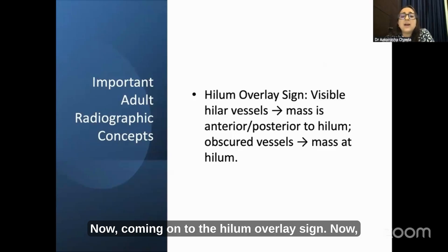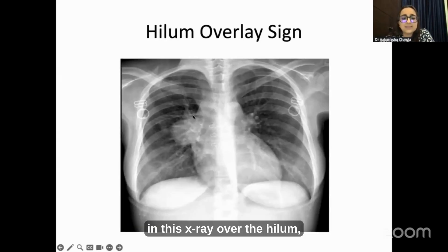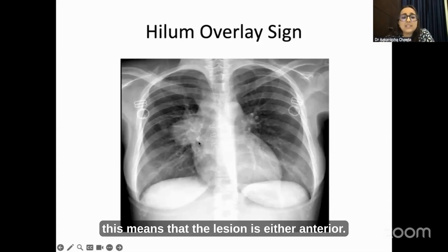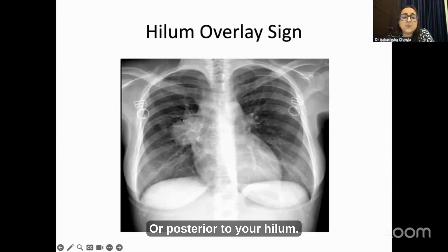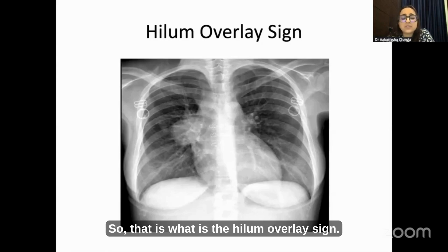Coming on to the hilum overlay sign — when you see visible hilar vessels over the hilum in an X-ray, this means that the lesion is either anterior or posterior to your hilum. If these vessels were not visible, that means your lesion is over the hilum. That is the hilum overlay sign.